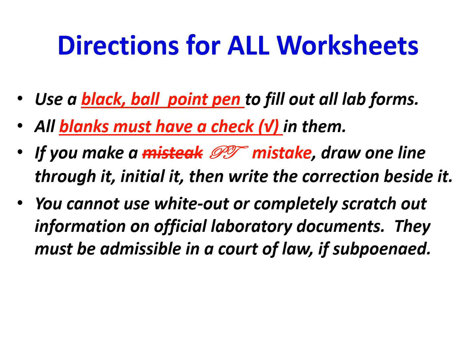And remember, if you make a mistake, we don't scratch out, we don't white out. These are admissible in court. These are laboratory documents, and we need to learn now how to appropriately fill out lab documents. You put one line through whatever your mistake is, your initials out beside it, and then what it should have been. So if you wrote down 120 and it should have been 140, then you put one line through 120, your initials as the person who made the mistake, and then 140 out beside that.